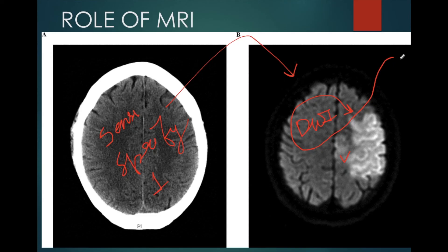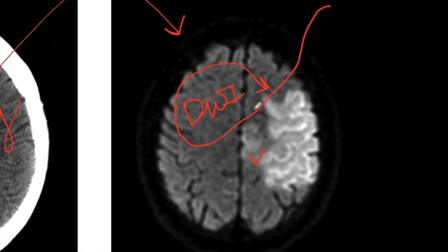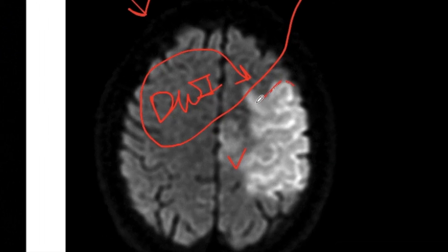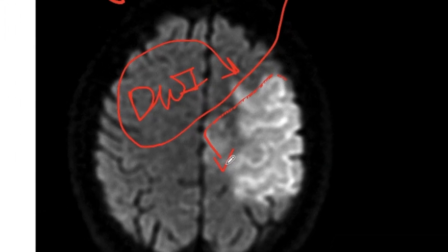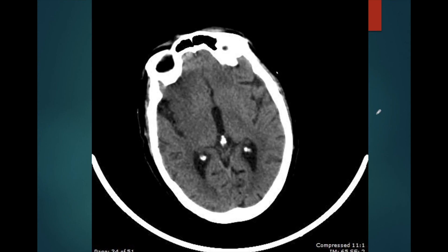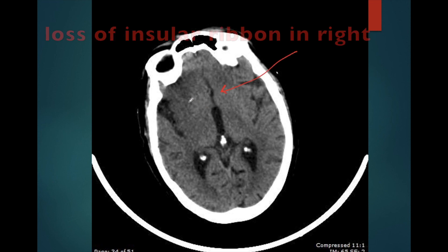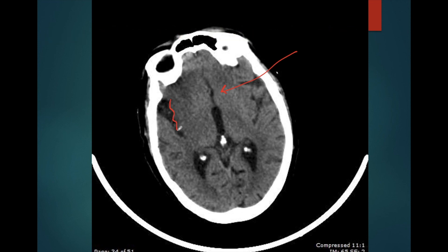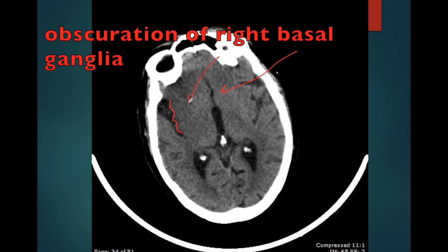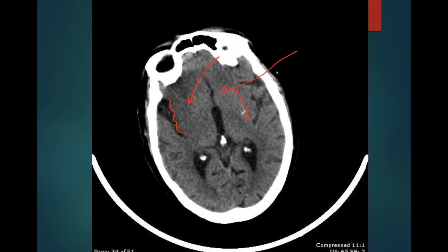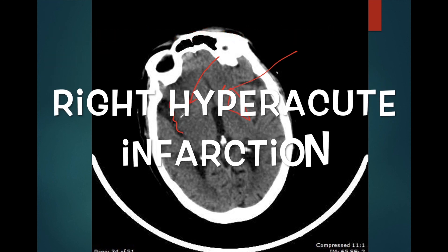Coming back to our original case: on this CT scan, we can see loss of the insular ribbon on the right side with the insular cortex appearing hypodense, and there is also obscuration of the right basal ganglia compared to the left side. So this was a case of right-sided hyperacute infarction. Thank you.